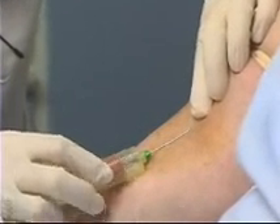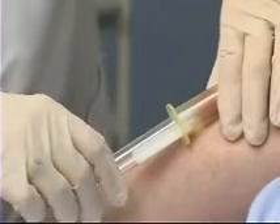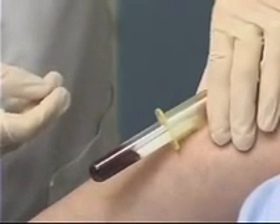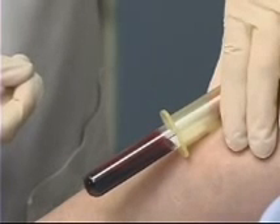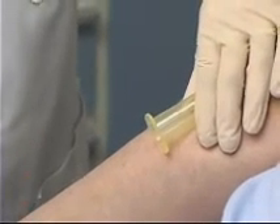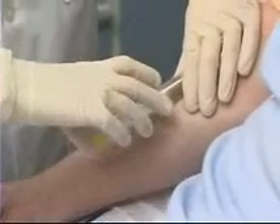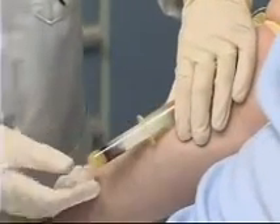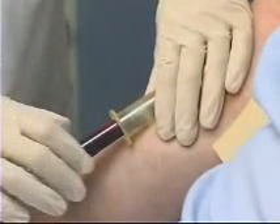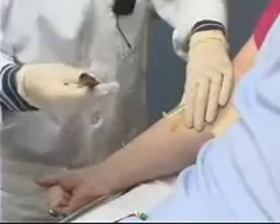At a very small angle, I'm going to insert the needle through the skin and into the vein. I'm now going to change the position of my left hand so that I'm steadying the vacutainer holder, which enables me to push the tube into the needle, creating the vacuum and allowing the blood to flow. Once I've filled that tube adequately, I can pull it out of the holder, giving it just a little shake. Taking the second tube and pushing it through the needle. This is my last tube, so when it gets to be about halfway full, I can release the tourniquet. I can then pull the blood collection tube away from the needle, taking it out and giving it a little shake.